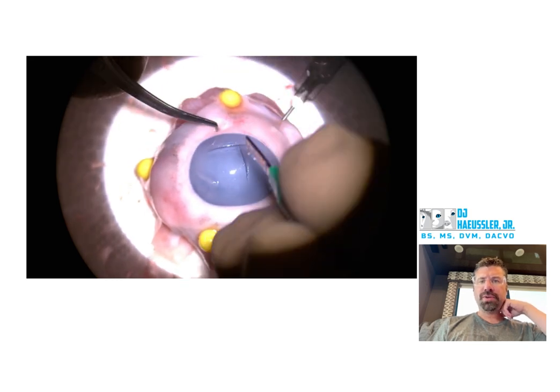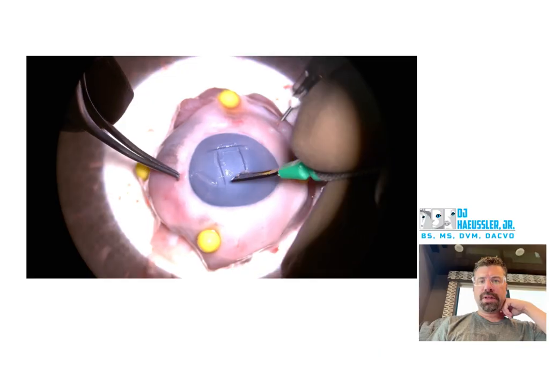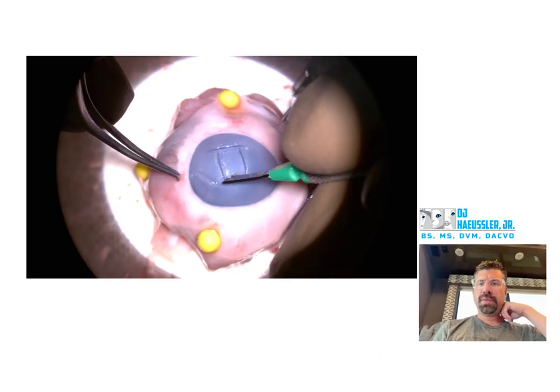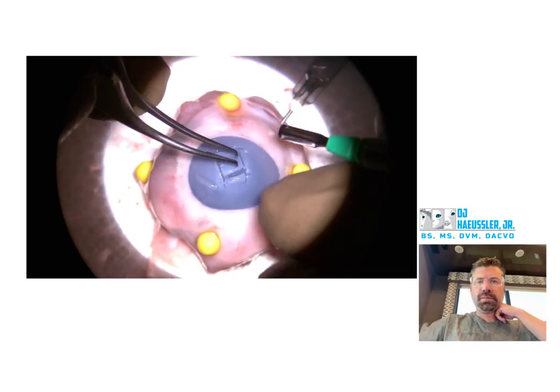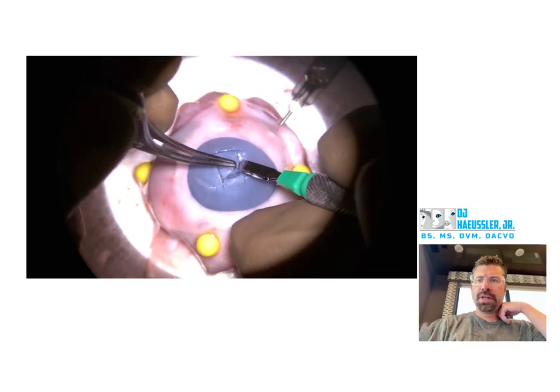All right, that's good that you're moving your colibri over. You want to make sure that these lines right here match up. Bring this line right here over to here so that those match up and you don't have that extra gap. You've got missing edges here, and those are all not lined up very accurately.